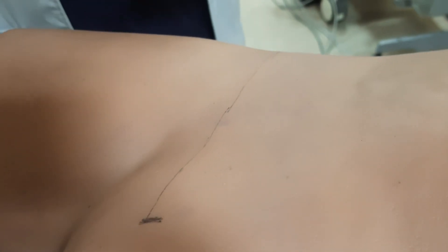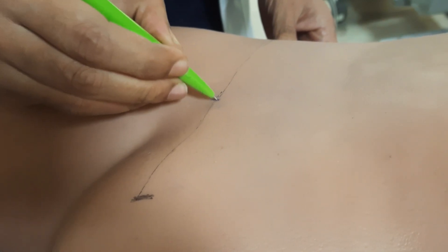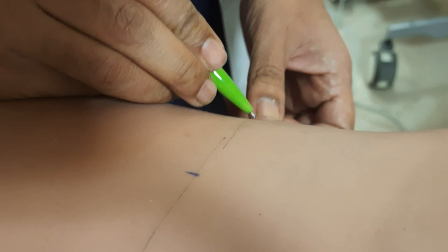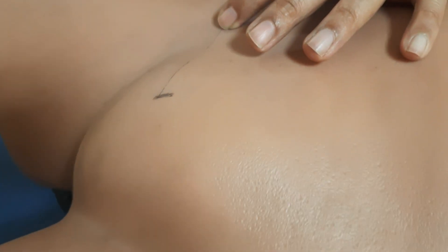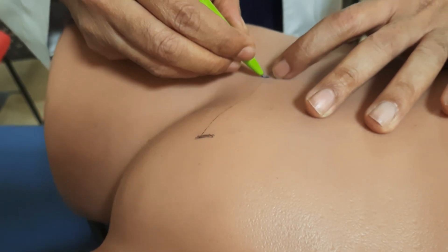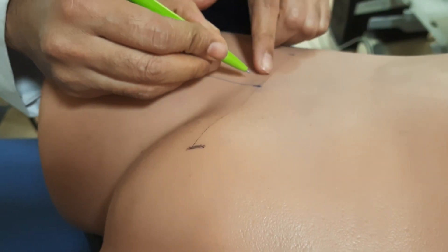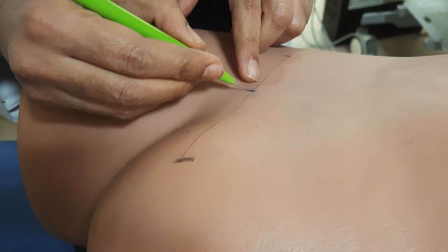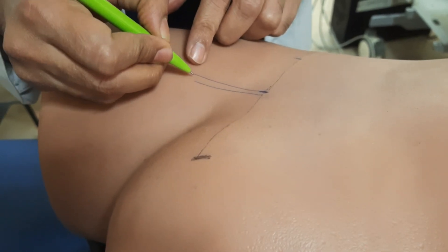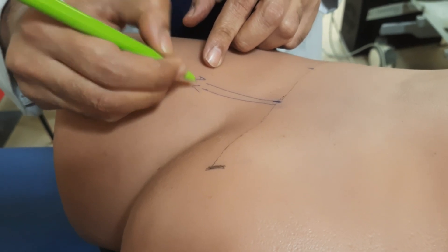We will join these two points and it will correspond to the inguinal ligament. We will divide this into three parts: medial one third, middle one third, and lateral one third. At the junction of lateral two thirds and medial one third, that is the point where the femoral artery lies, and just medial to the femoral artery — around one centimeter — there is the femoral vein.